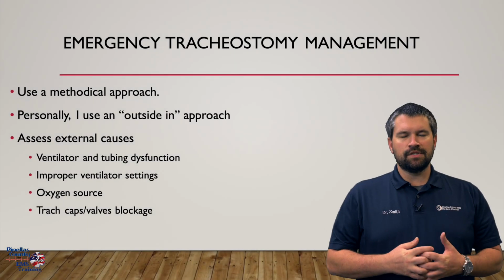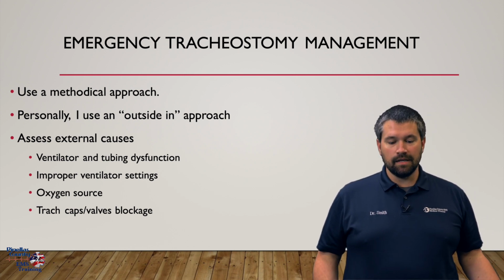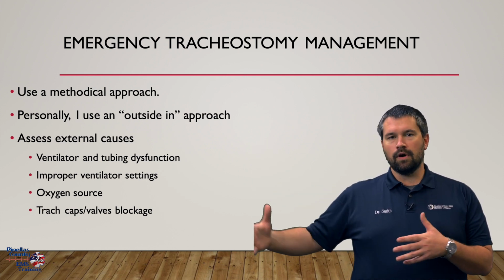Once you've established all your equipment is ready and you're actually assessing the patient, you want to use a methodical approach. Personally, I like an outside-in approach. I look at the external devices, the oxygen sources, the ventilator itself, before I ever move on to the patient.